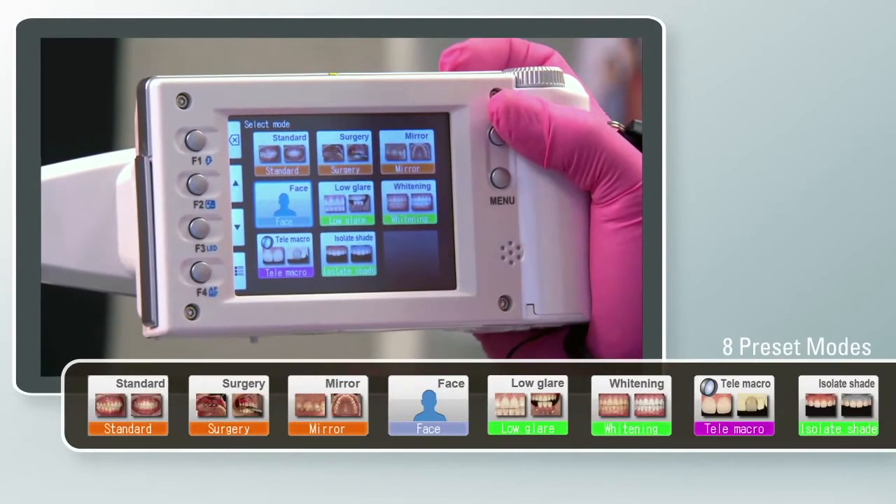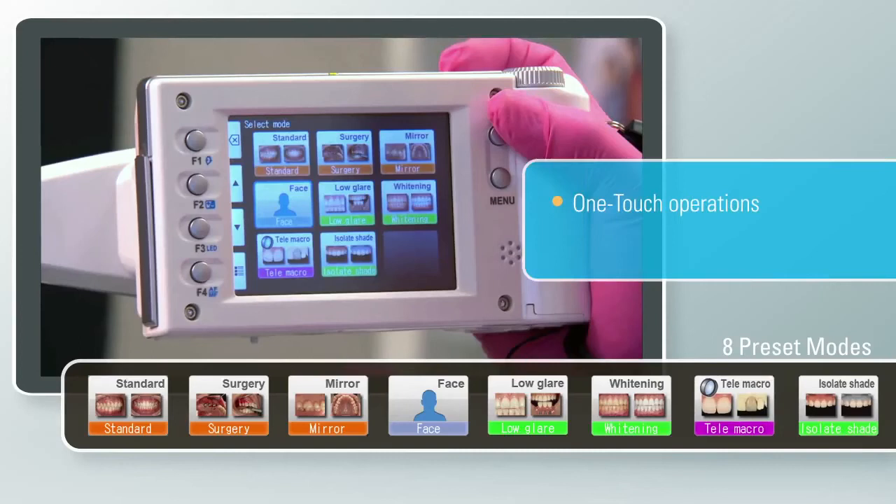The smart and sophisticated iSpecial C2 has eight preset dental shooting modes: Standard, Surgery, Mirror, Face, Low Glare, Whitening, Tele Macro, and Isolate Shade. With one touch, you can quickly switch from mode to mode to achieve high quality, consistent case photos.